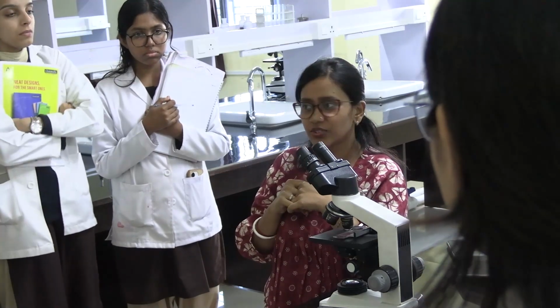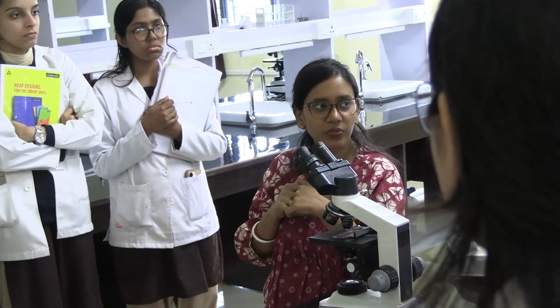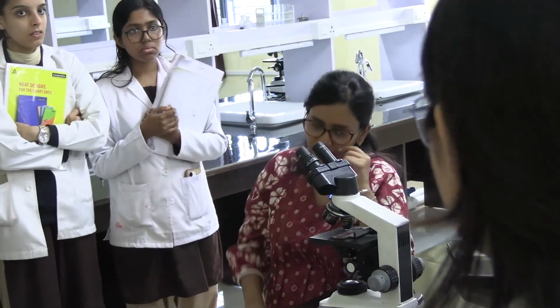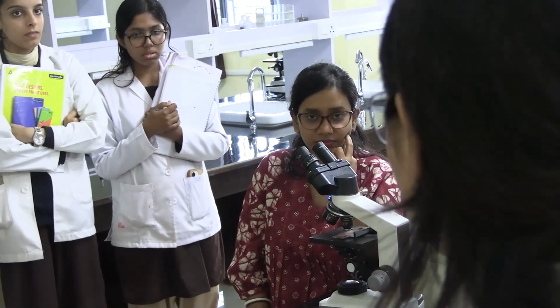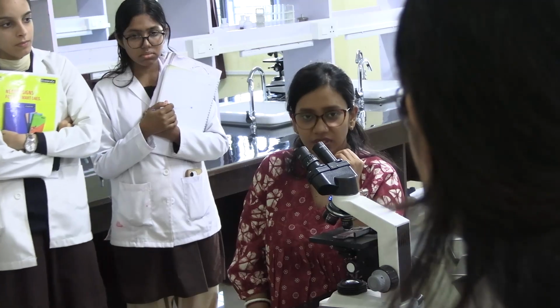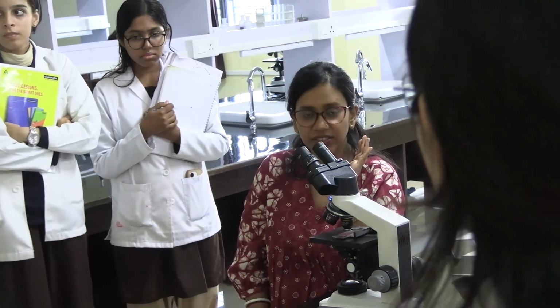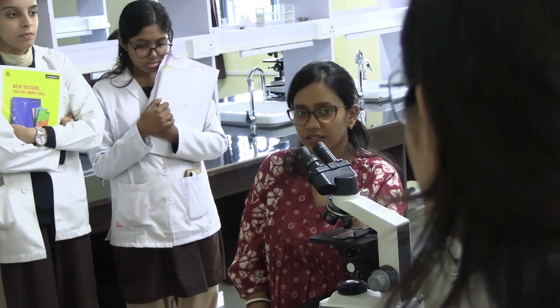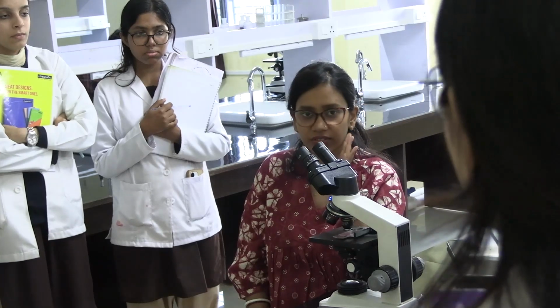Okay? So now you have noted down. Who will tell it to me? What are the points that we have to say? Very good. Hyperchromasia of the nuclear chromatin. And you missed one more thing. Basal polarity. Okay, basal polarity. Another one. Invasion. Okay.